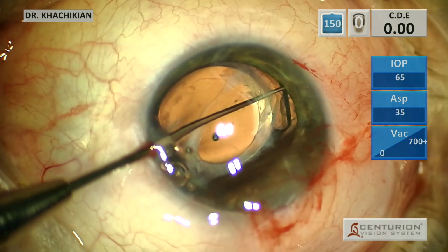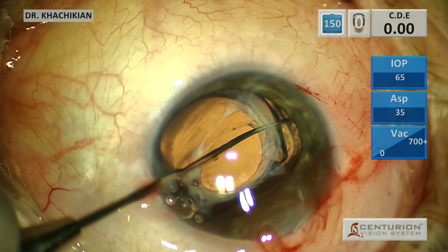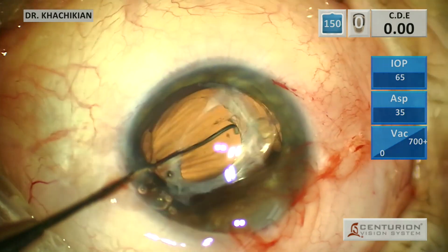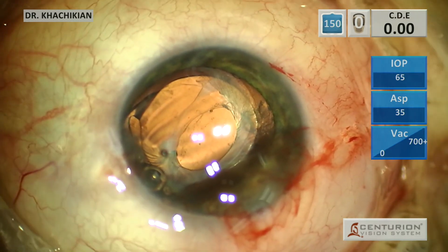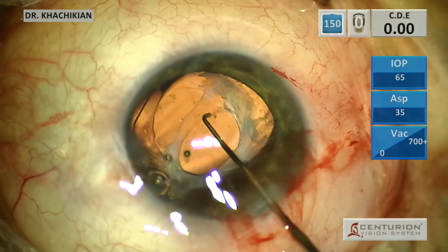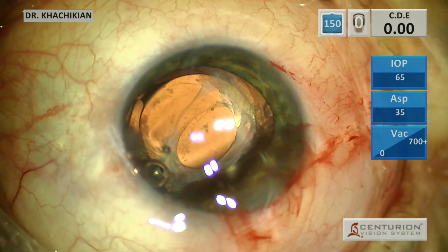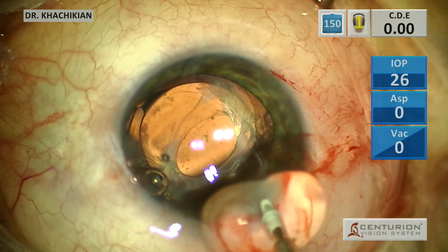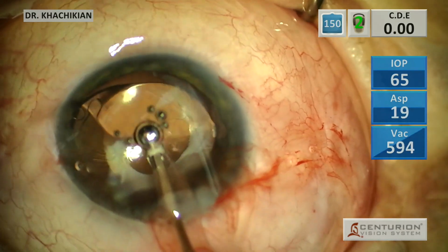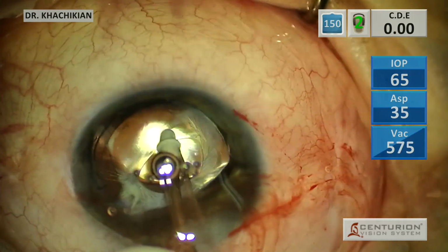Probably a little more torque on those zonules than I wanted to see, in reviewing this case. You can also question whether there's more cortex out there. It looks like the cortical cleanup was really not good during the original cataract surgery. All right, so now both haptics are free and not intertwined with the capsular tension ring, and the ring appears to be in the fornix of the capsular bag, which is awesome. That's exactly what we want.